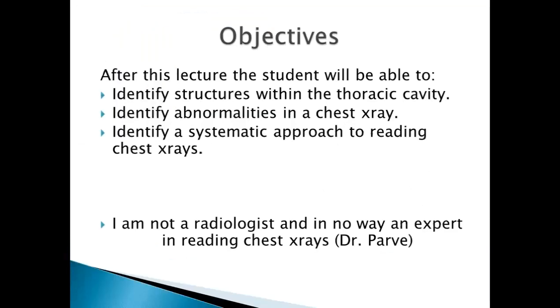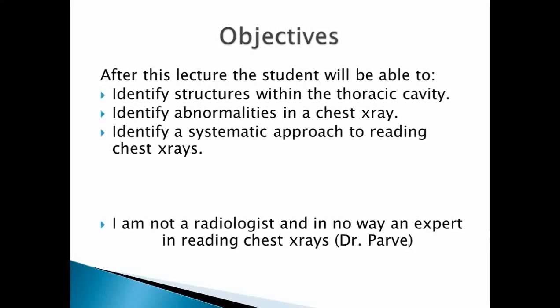I am by no means an expert in reading chest x-rays, but I think it's important for the nurse practitioner to be able to at least look at a chest x-ray, have a systematic approach to reading it, and know if it's normal or abnormal. You might not know specifically why it's abnormal. You might see something and think, it's not normal, but I don't know what it is. That's okay, a radiologist will read it too. But you should be able to look at a chest x-ray and tell something without just staring at it, not knowing what to do.